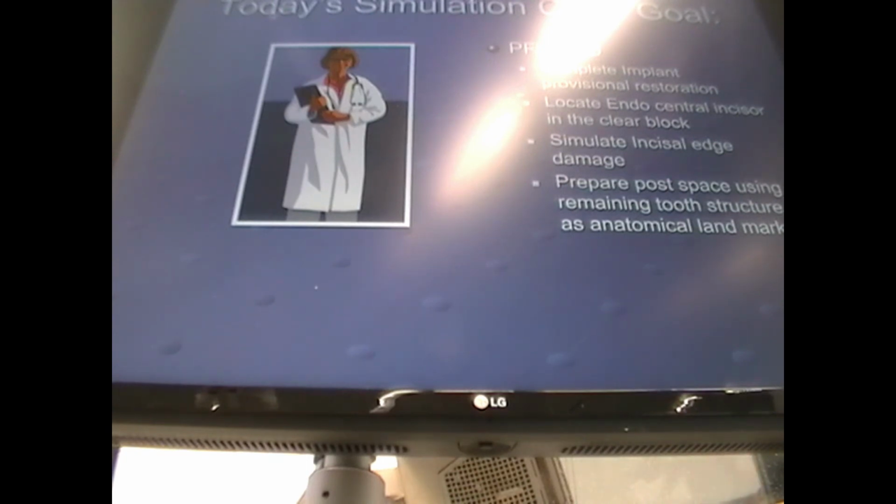If you have anything wider than that little circle that you can see on your provisional abutment, you're impinging on tissue, and I know that you think it'll make the tooth look funny, but you only want to have a 1 millimeter margin at that cervical third of the provisional. This is a really easy way to make points on a competency, and a real way to get in trouble is to have a big, wide 3 millimeter margin that impinges on tissue. Okay?